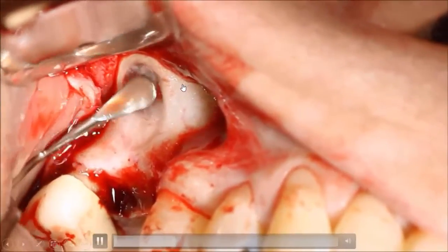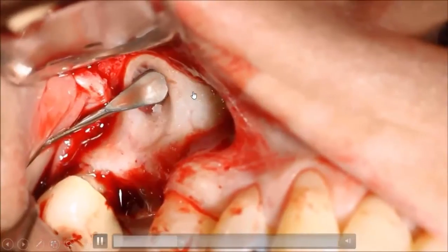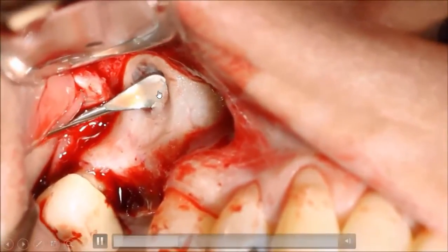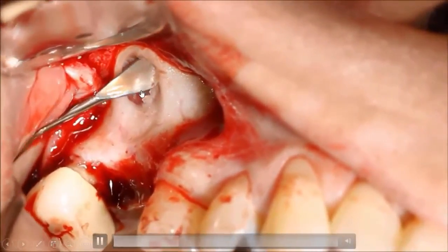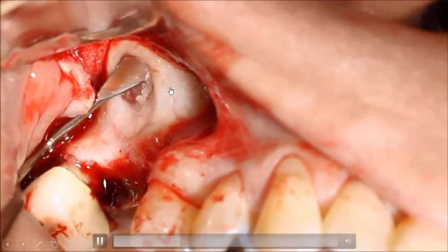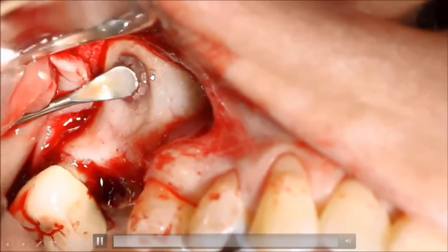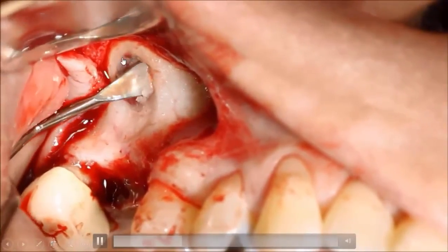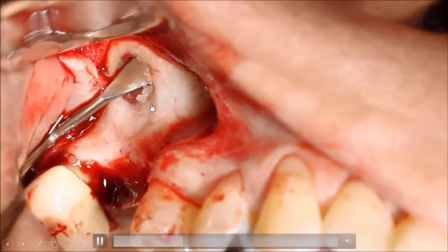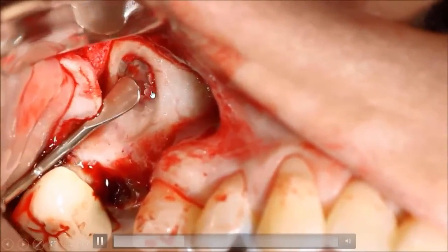هون مثل ما شايفين we started using a special tool, a special sinus curette. The convex part should be toward the membrane, the concave part toward the bone, and always resting on the bone. And personally, I like to start with the anterior, superior border, distal border, and lastly the inferior border. شايفين هلا الطبقة رقيقة من العظم هون.